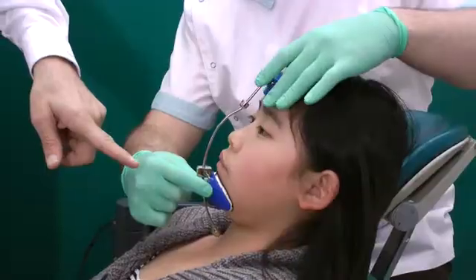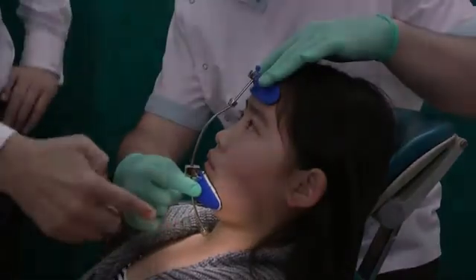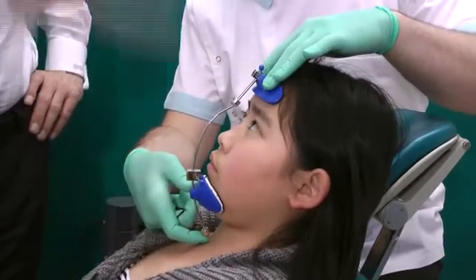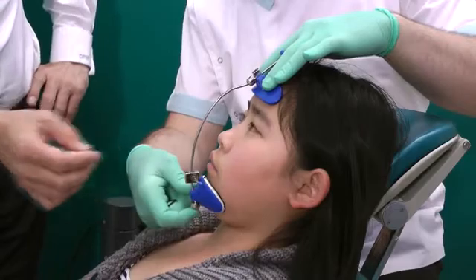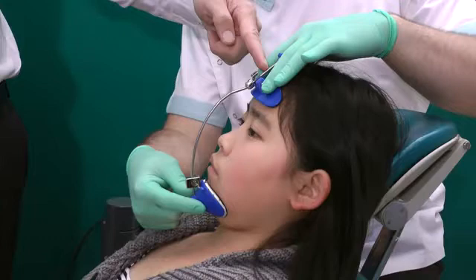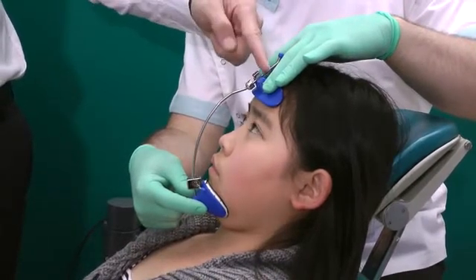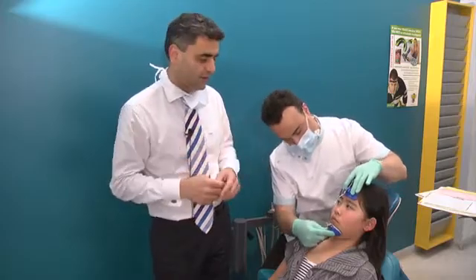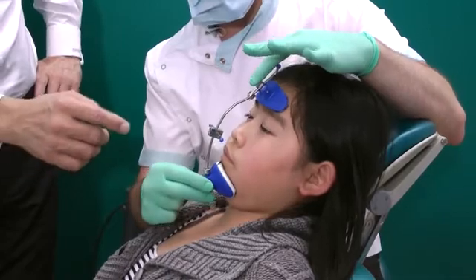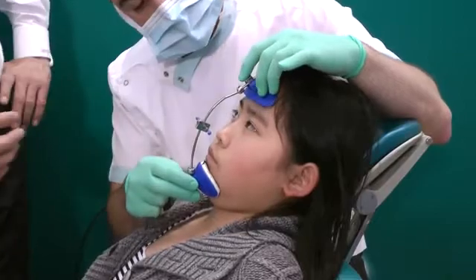That is a big no-no. You can see on the profile — if she rolls over asleep, that's going to cause some serious injury. If instead you can push it straight up, that's correct. You can cut this anywhere you like and put the cap back on — it's very easy to do with a high-speed handpiece and a Joe Dandy disc. Just showing the adjustments: the forehead strap here is probably a little too low, rubbing on the eyebrows. We'll just pop the forehead strap up a bit.